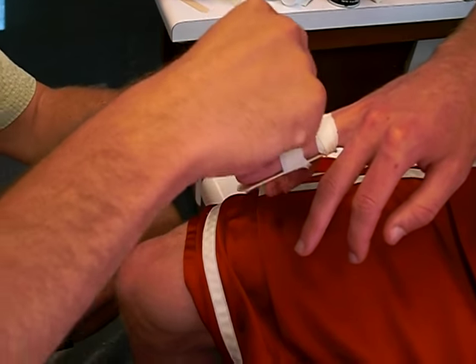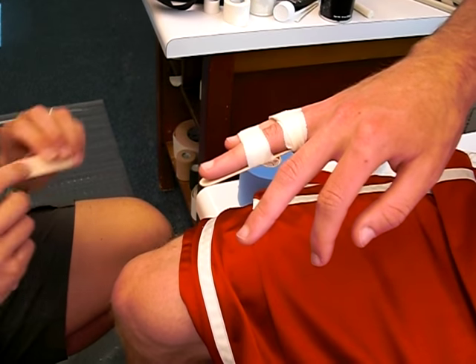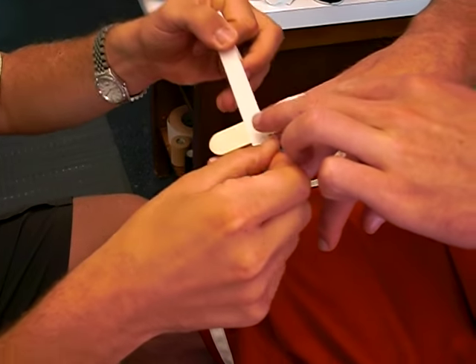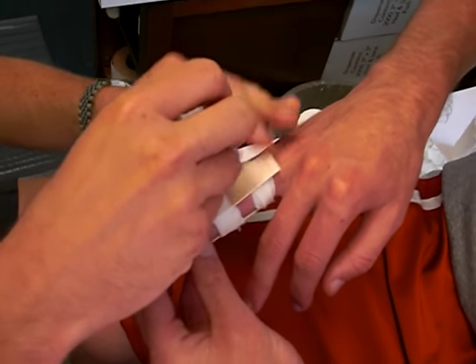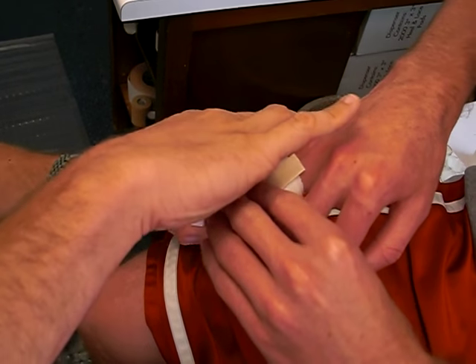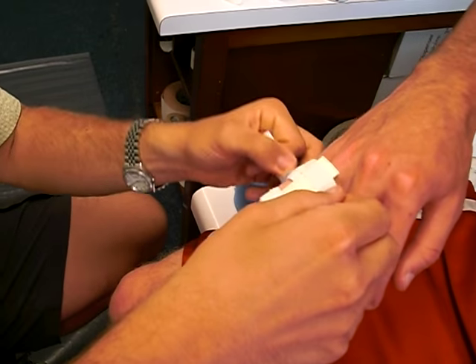You don't want to pull too tight. If you want, you can also put one on top as well. All I'm using here is a tongue blade for improvisation, but you can also use an actual finger splint, which most rooms should have.